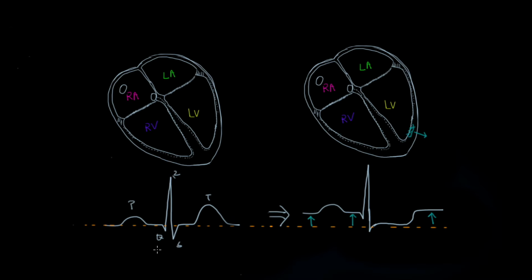What that means is even at rest, you have an overall baseline, if you imagine like some noise or the signal here persistently there, right here, except when everything depolarizes after the ventricles depolarize, right? Then there's nothing else for things to depolarize around the ischemic tissue. So it'll go back down to its isoelectric line right here. So what this overall looks like is an ST segment depression, because you don't have what the normal was to compare it with on the ECG.